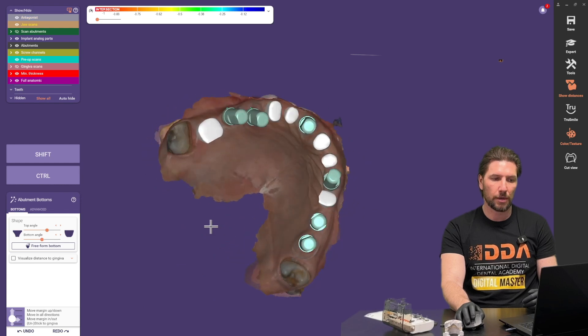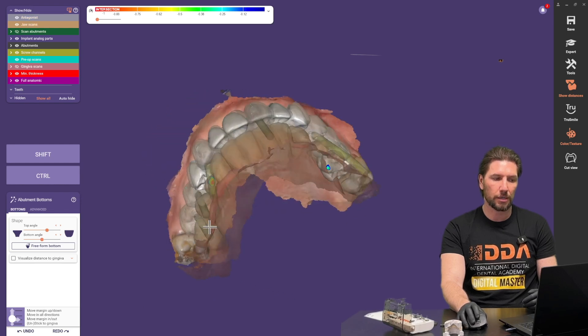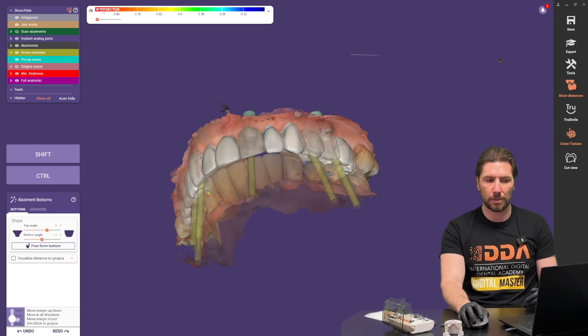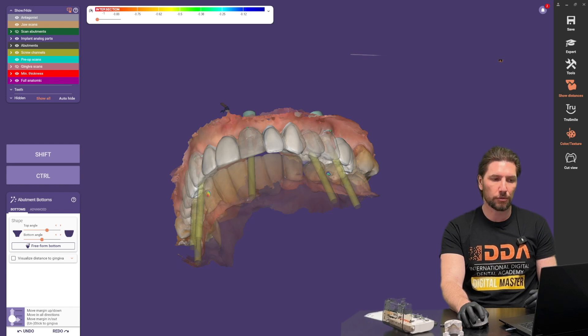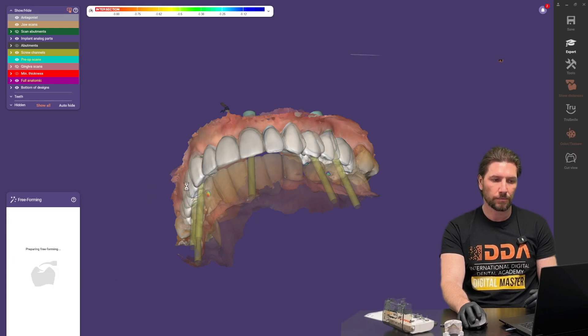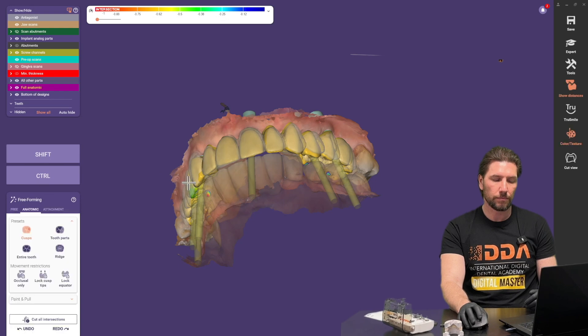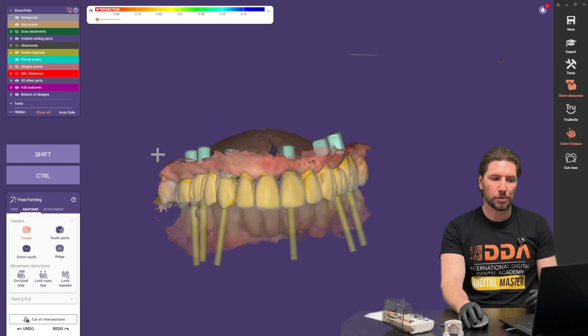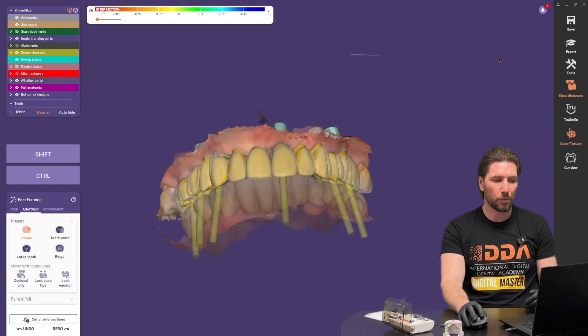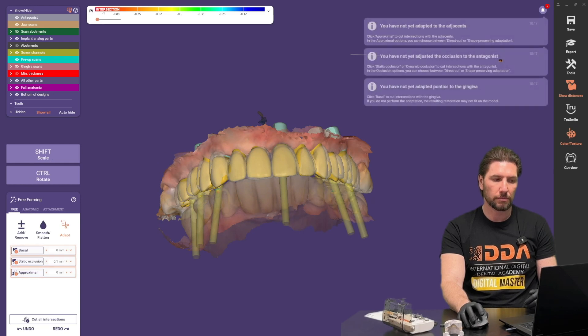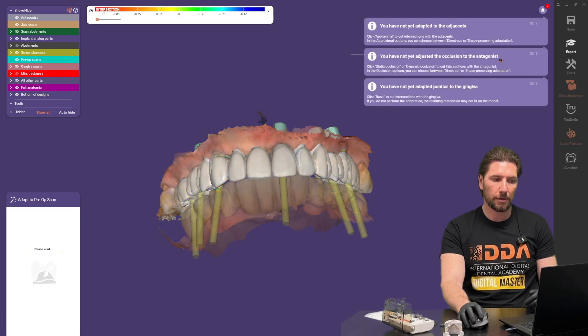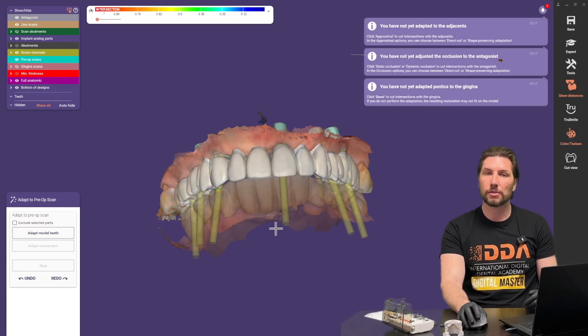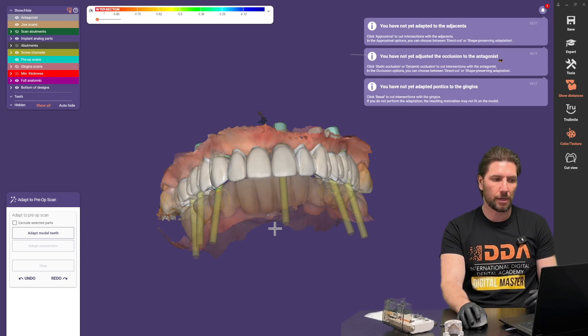So if we click next it's asking us now to bring in and adapt the abutment bottoms but again because the emergence profile there is none so we're going to click next. And it'll give us the option to freeform but we're going to ignore that again. So I'm going to click next and next and that takes us to this stage.